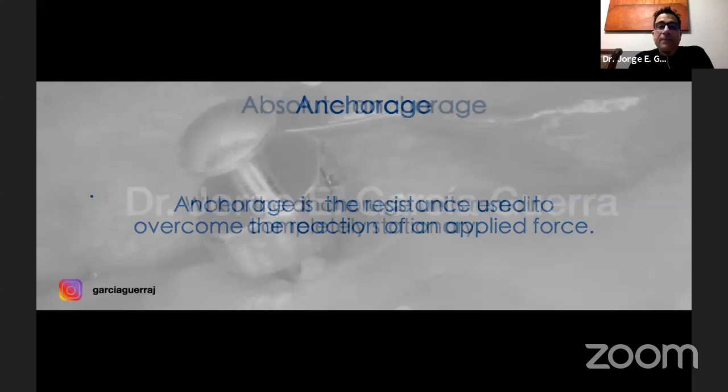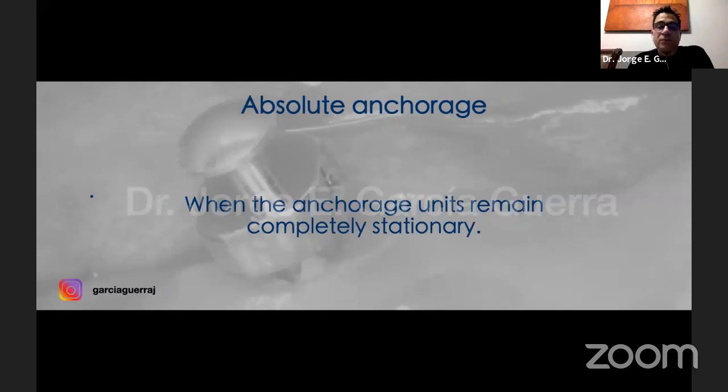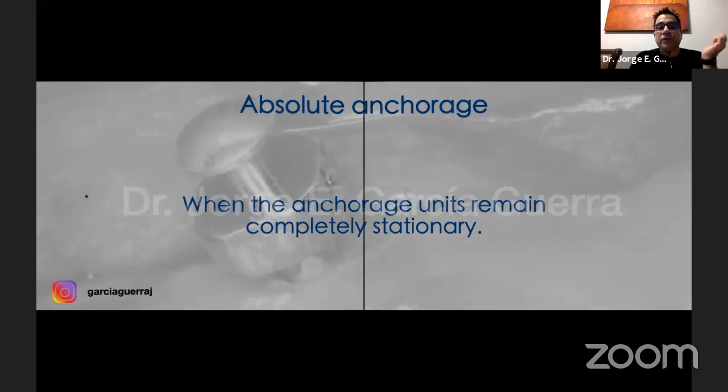Now, one term is absolute anchorage. This is what we refer to as absolute or total anchorage, when it remains completely stationary. With normal appliances, we never had certainty of having absolute or maximum anchorage. But now, with skeletal anchorage, we can be sure that we're achieving it.